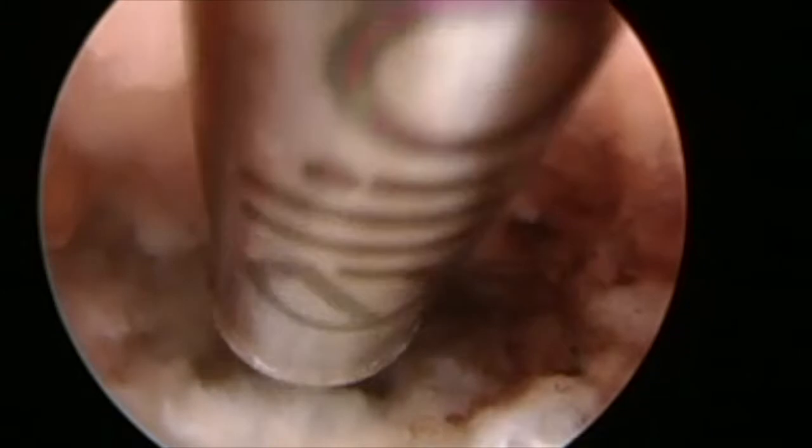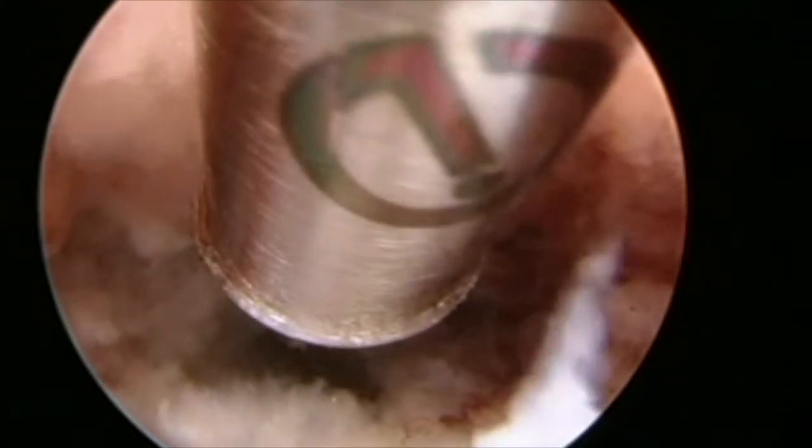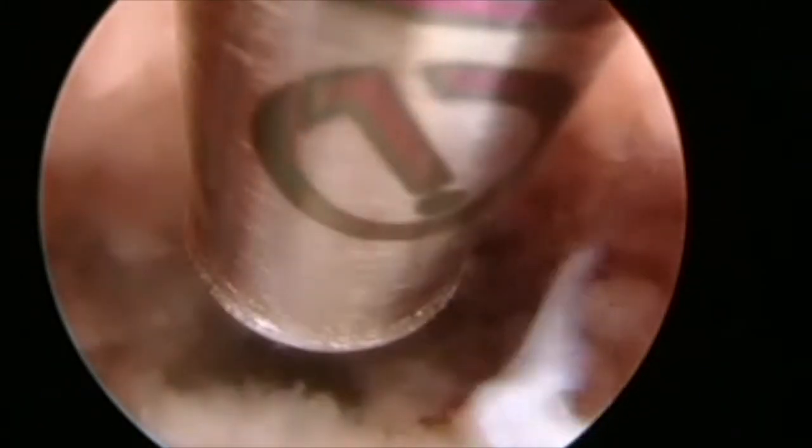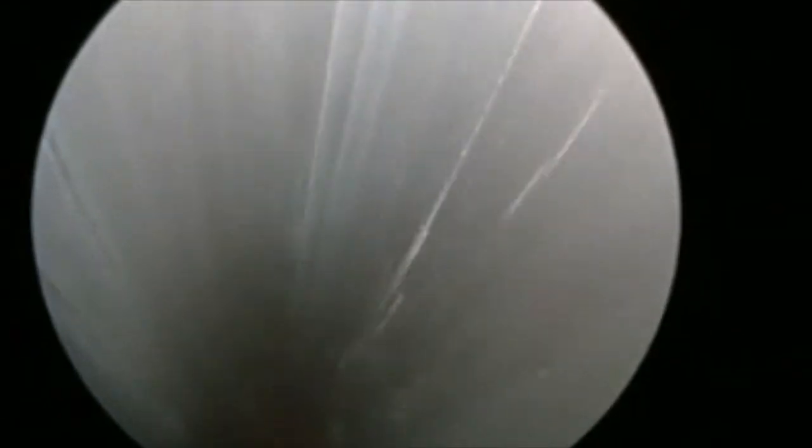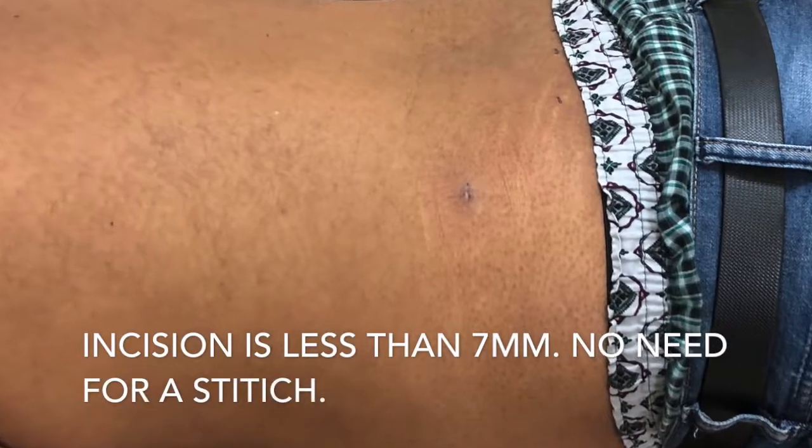Further disc fragments were probed using Penfield and nerve hook. However, no further fragments were found. The radiofrequency was used to probe right across the epidural space, and on touching the right-sided nerve, the patient was getting right leg pain as well. So I knew that the decompression was thorough.